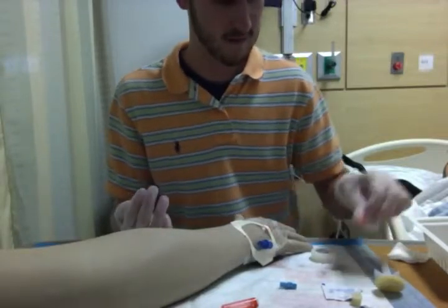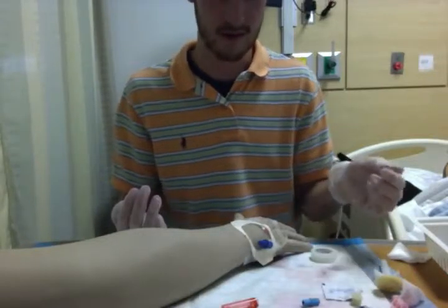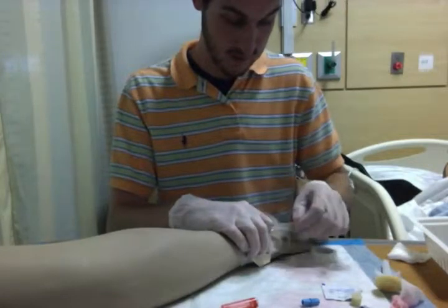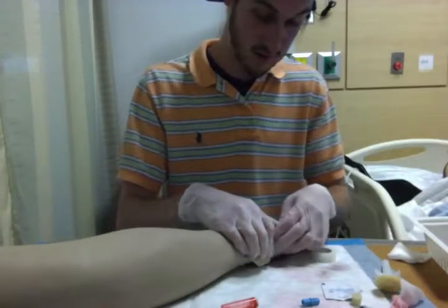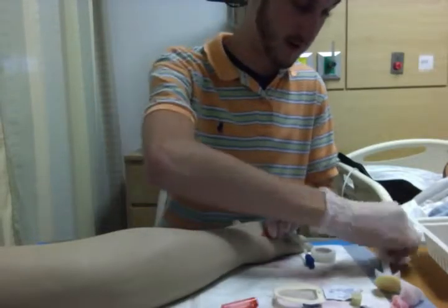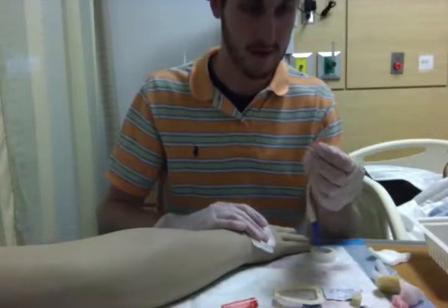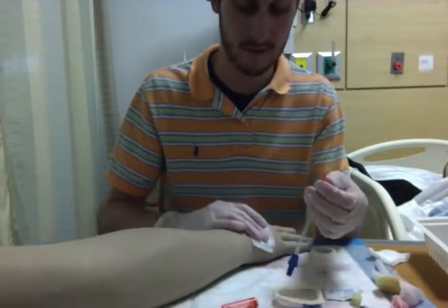Then clean up my supplies and put everything in the trash that needed to be. To discontinue it, I would come back in, take off the tape, take the Tegaderm off, and get my gauze. Make sure to apply pressure on the site, and then slowly pull out and inspect the angiocath once I take it out, to make sure that there's no piece of it breaking off.